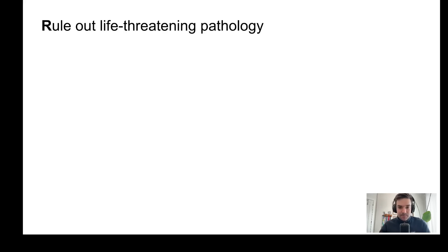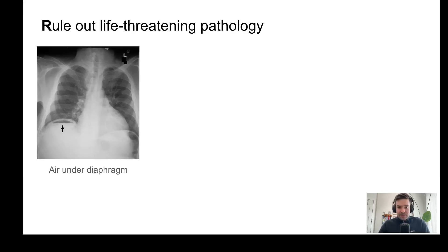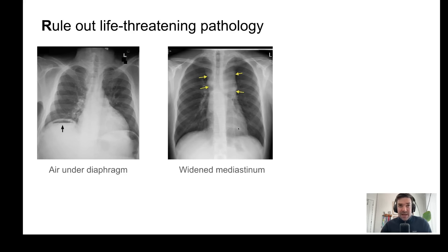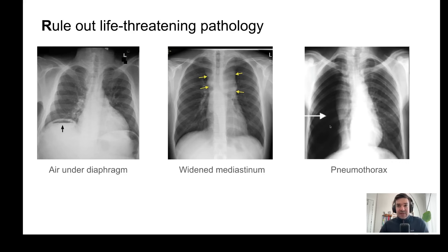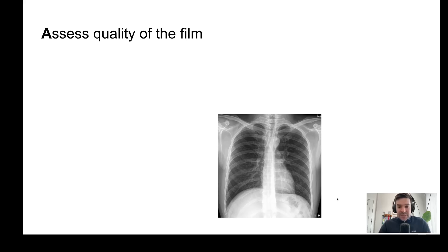Ruling out three important life-threatening pathologies: the arrow sign shows air under the diaphragm, which suggests somebody has potentially perforated their bowel. A markedly widened mediastinum can suggest an aortic dissection. And here, a very large pneumothorax — usually pneumothoraces are not this obvious, but you can see it's all black and there are no lung markings whatsoever.